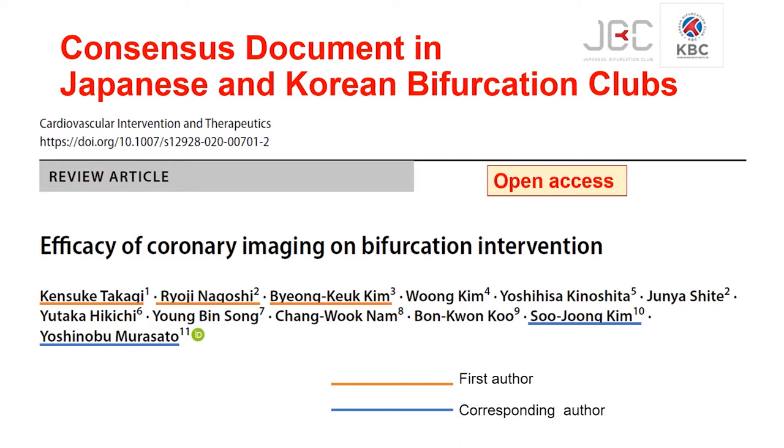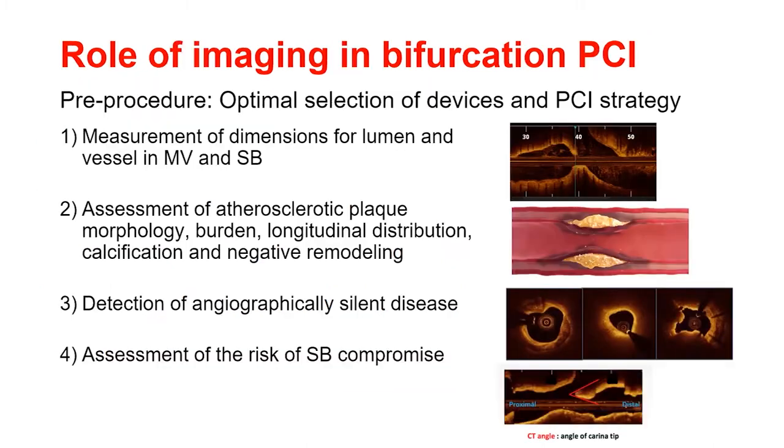Recently, the Japanese and Korean bifurcation clubs published a consensus document on coronary imaging in bifurcation intervention. We restate the roles of imaging in bifurcation PCI as follows.